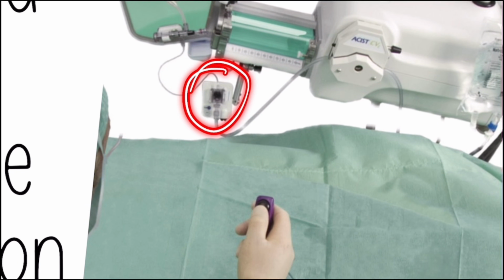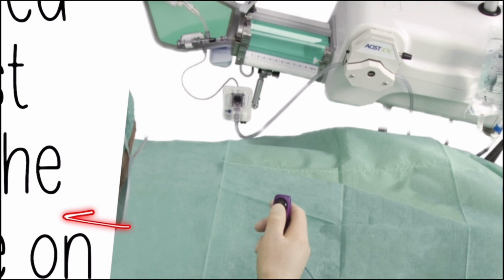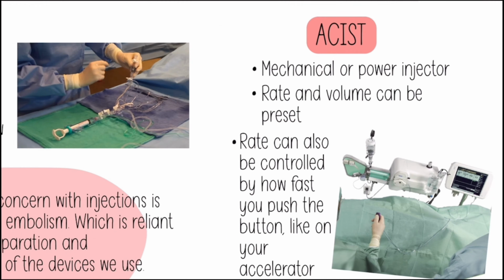It does have a transducer to transduce pressure as well. And again, I know you can't see all of it, but it does directly connect to the catheter. And this has some mechanisms in place where it can detect air and it will not inject if there is air present in any of the device.